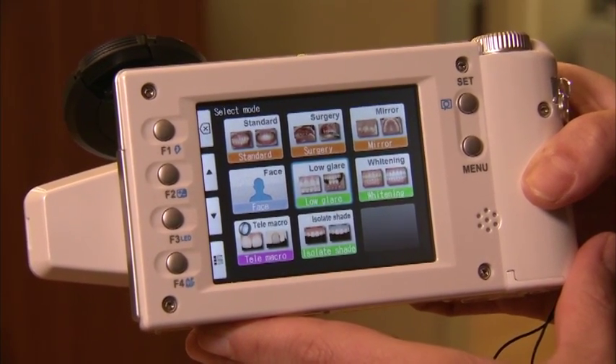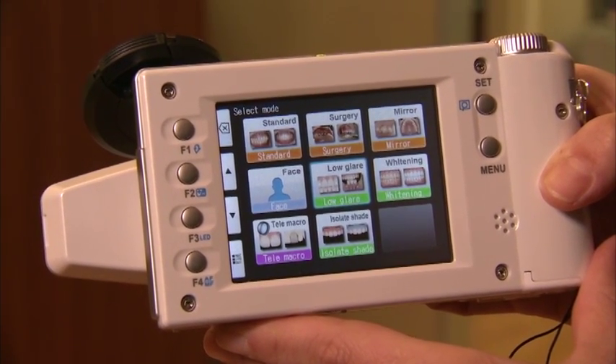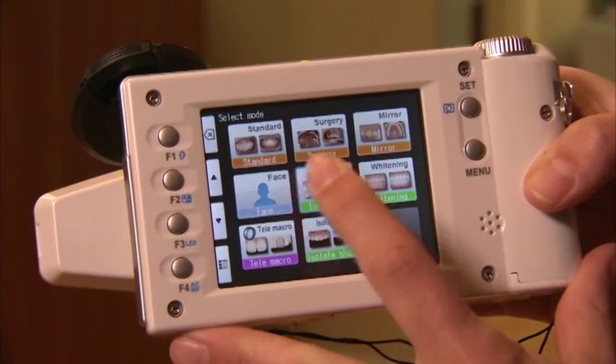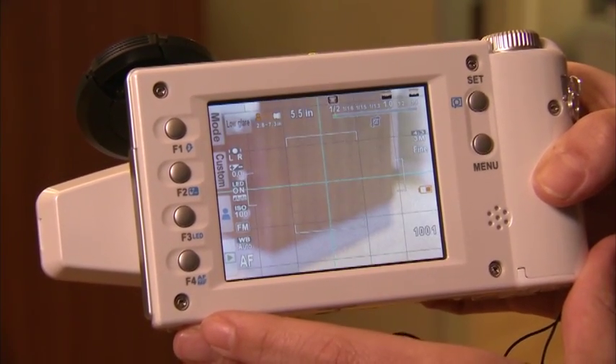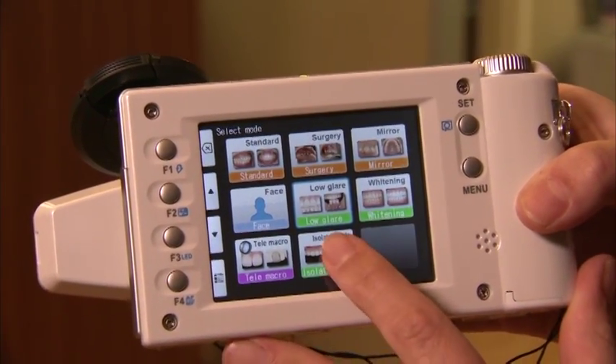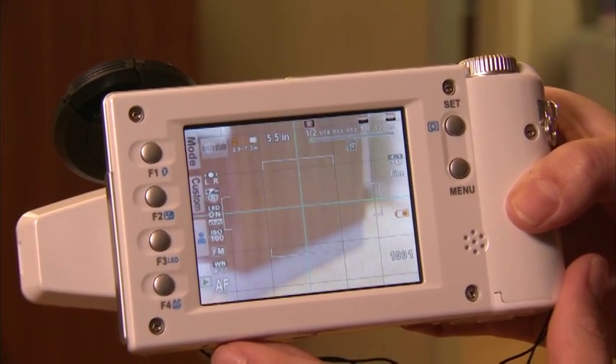If you choose the low glare button, it defaults to a fairly close-up view and, like previous modes, you can see how far away you should be from your subject — about 5.5 inches. Similarly, with the isolate mode, you'll also be about 5.5 inches away.